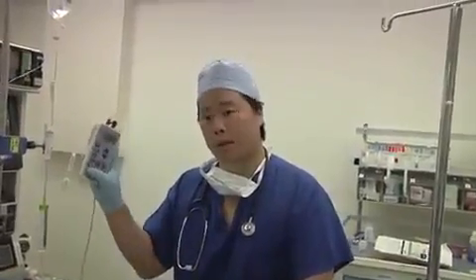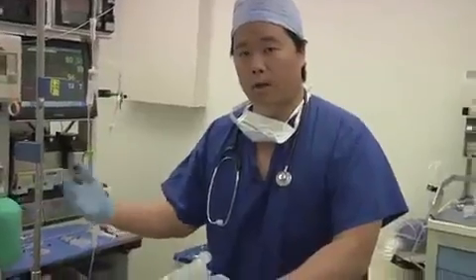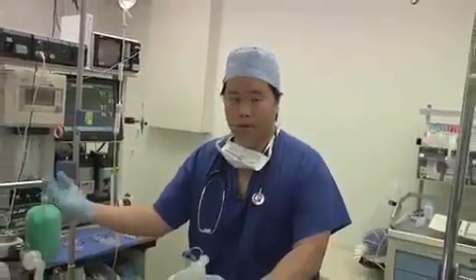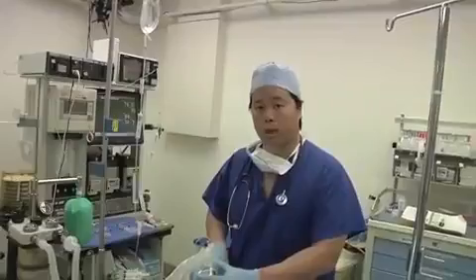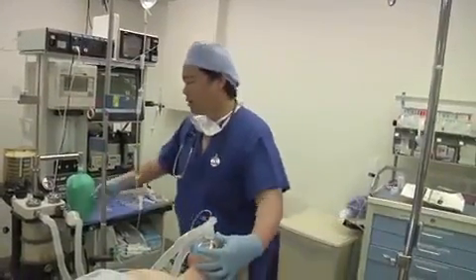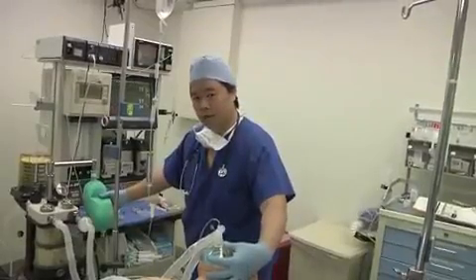And you can set this device to trigger a train of 4 nerve stimulation continuously during your induction until you see that the twitch fades. And at that point, you know that you've established adequate neuromuscular blockade for your patient. And during this period of time, you should also continue to mask ventilate the patient.